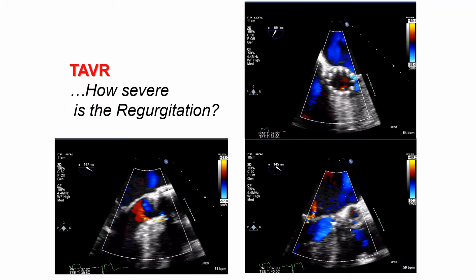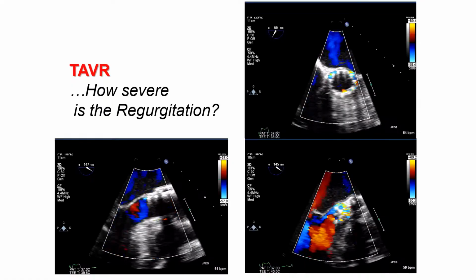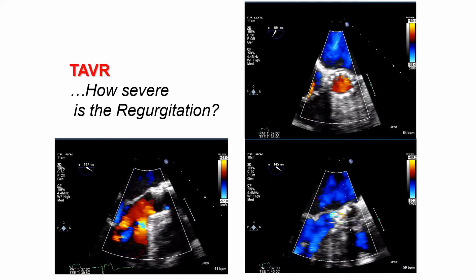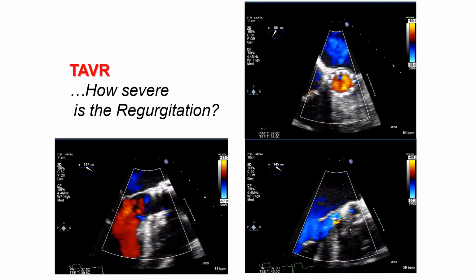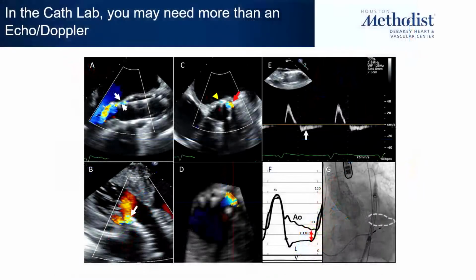So you need to have a good sweep in short axis, and once you determine something, you may go offline to try to identify where the aortic regurgitation is, and you could see that here in this case. You have to go in the right lower area. You have to go very eccentric. You're not seeing the valve anymore. You're trying to see where the issue is of regurgitation.